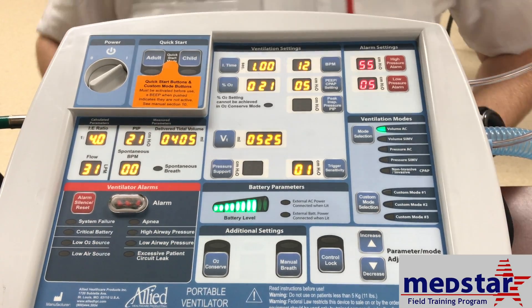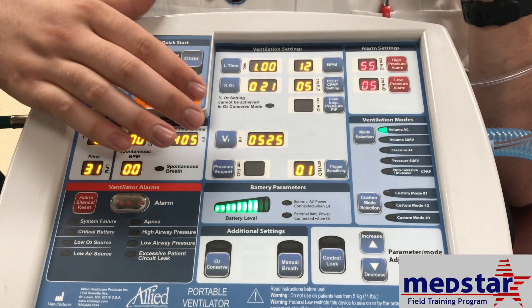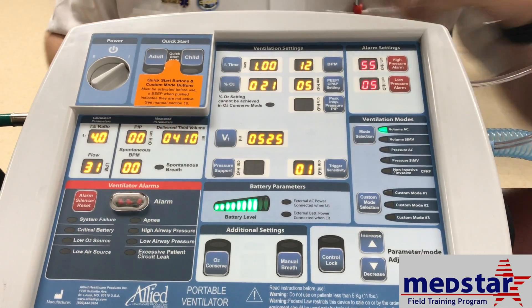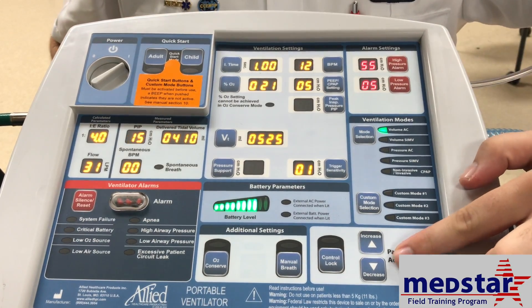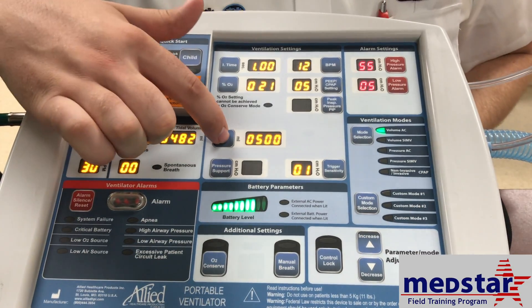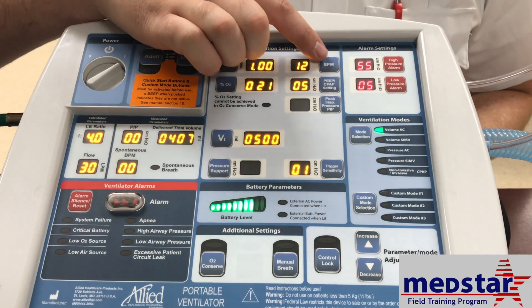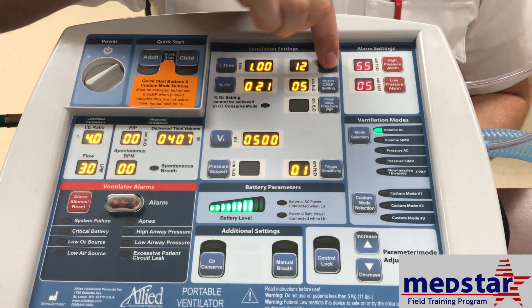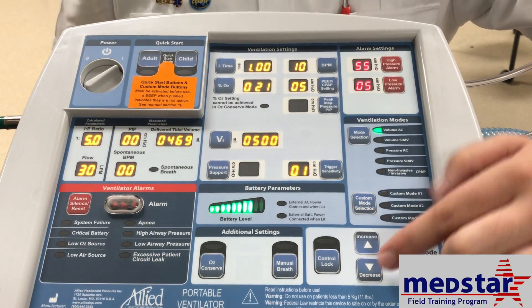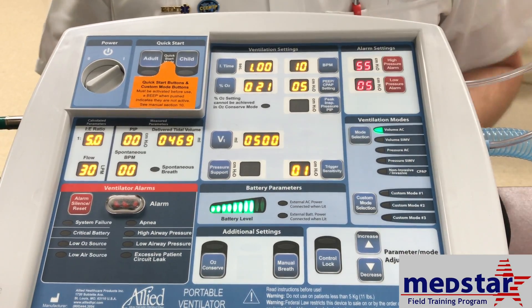To change a value once you have settings from the respiratory therapist, select the value you want to change and use your increase or decrease arrows to adjust it — for example, changing the tidal volume down to 500 — then select again to save the setting. To adjust the respiratory rate, select it, use the scroll to increase or decrease, then select again to save.